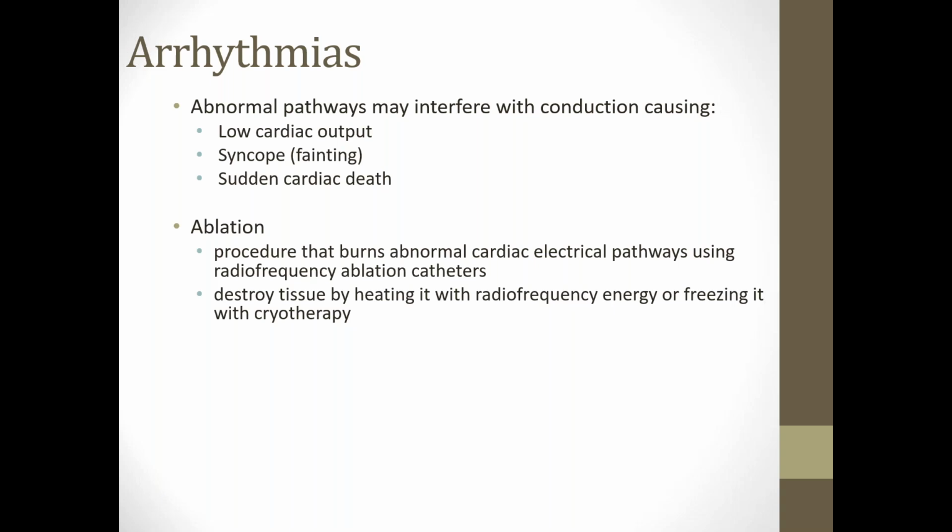One of the procedures that they do is called an ablation. What they'll do is they'll use a mapping system in the heart and some EP equipment, and I call it predator vision because it comes up in all these weird predator colors, if anyone's seen the movie, in purple and red, green, and all this stuff. That's what the image looks like on the screen. Each different color represents a different pathway in the heart. So say if you needed your SA node ablated, then they would look for all the places of the purple. That's the color they're using for your SA node. And then they're able to map that.